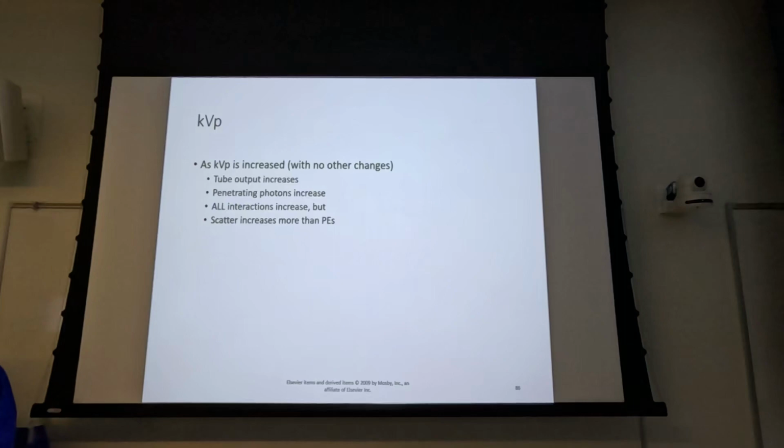Or you may have one that says, as KVP increases, the ratio between photoelectrics and Comptons, you get an increase in photoelectrics compared to Comptons. That would be false. Or you get an increase in penetration compared to Compton. That would be true.